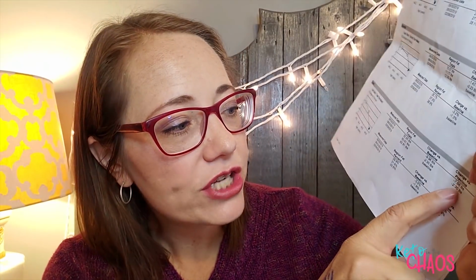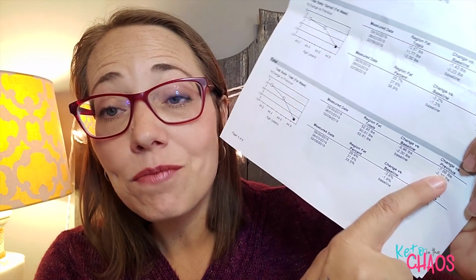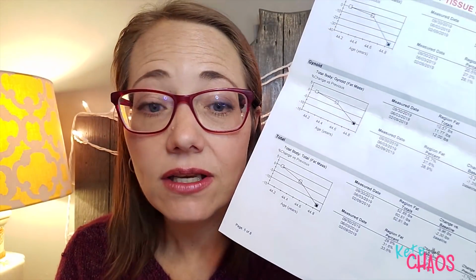And obviously, the gynoid is where it wants to keep it, and it will keep it until you force it to let it go, which I will not be doing at the given moment. But suffice it to say, that's where your body wants to keep it, and that's just the way it is. So my total change did go down. Total change minus 7.66 pounds of fat from June to October, 16 weeks. That doesn't sound like a ton, but when you're at the point where I am, that's actually not a bad amount of fat to lose.